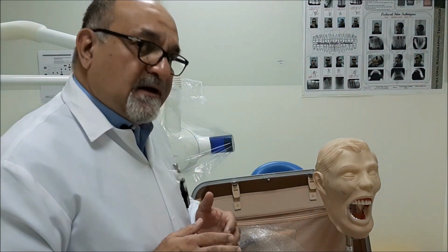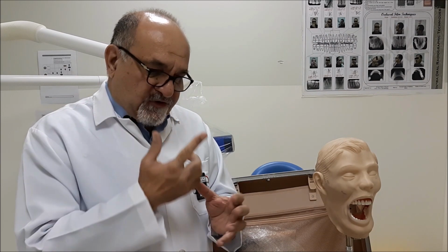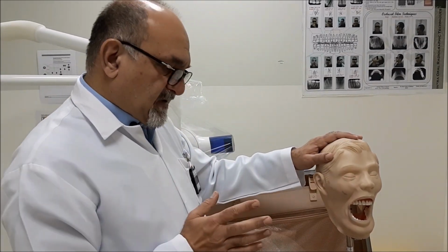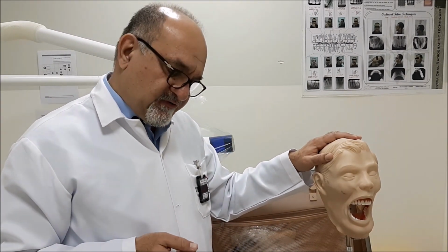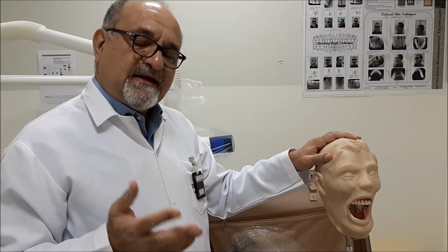So in the tube shift technique, suppose we have a patient, which is most commonly done in endodontics and in surgery, who has two canals, like in an upper four, a buccal and a palatal root.